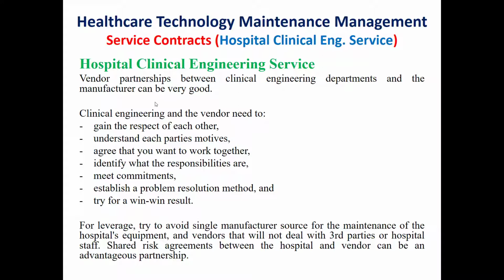The clinical engineering and the vendor need to have a good relationship, gain the respect of each other, understand each party's motives, agree that you want to work together, identify what responsibilities are, and meet the commitments, establish a problem resolution method, and finally try for a win-win result. So try to make this relation beneficial for both sides, for the hospital and the manufacturer.